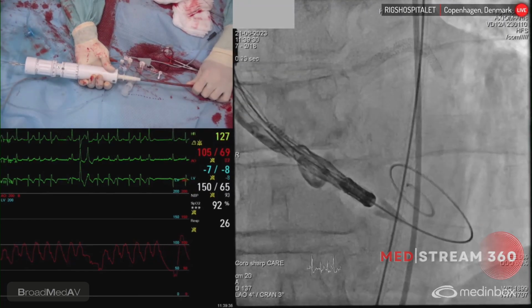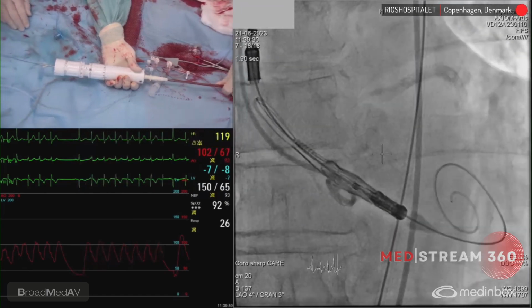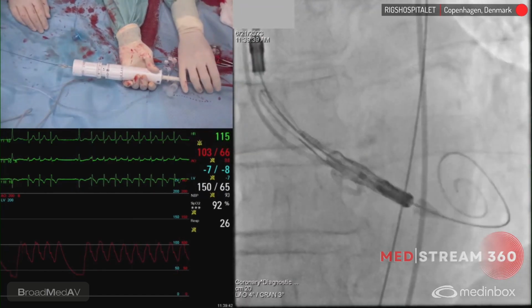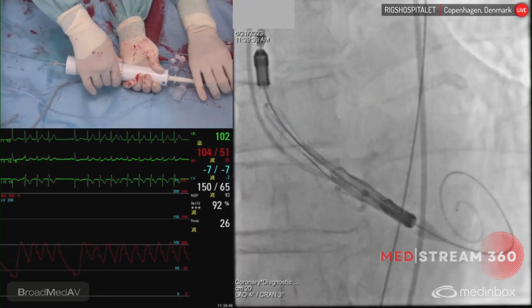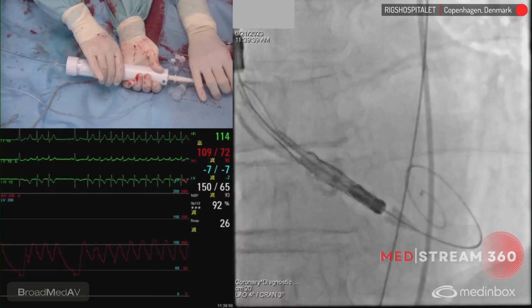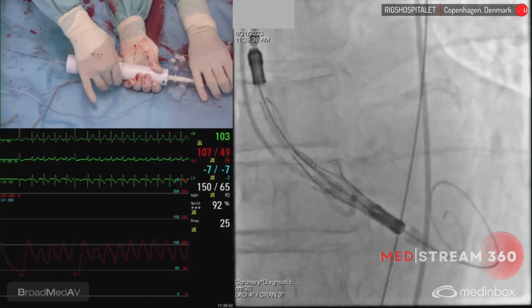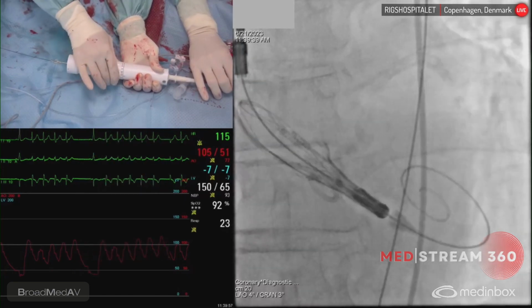Yeah, we're almost there. We cannot push it lower, because then the upper crown will be below the calcium. So I think this is the right moment to start opening knob number 1 carefully and slowly. With the final deployment, we can go. Yeah, that's good. So the upper crown is above the calcium. That's a good thing. I like it.